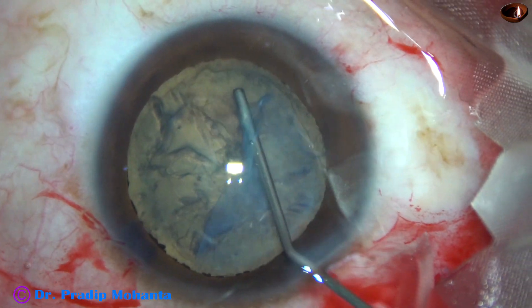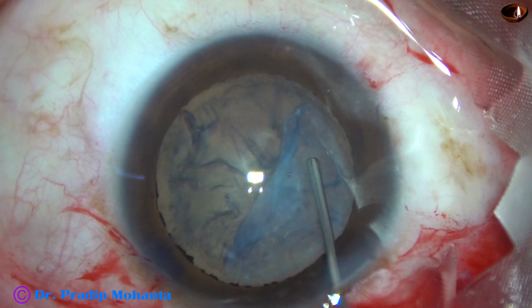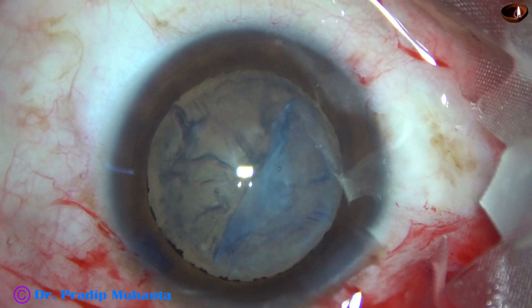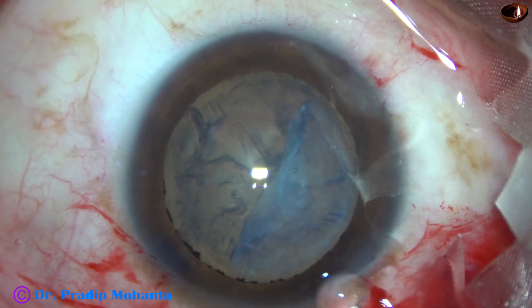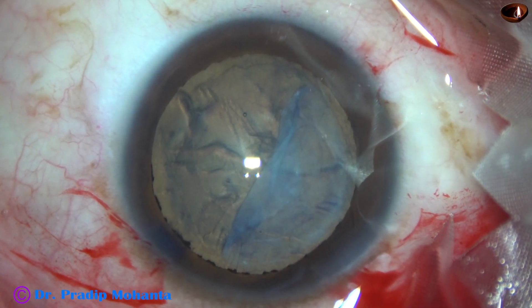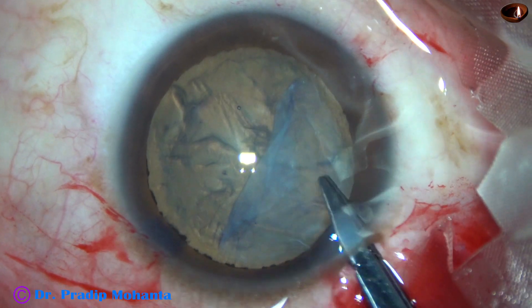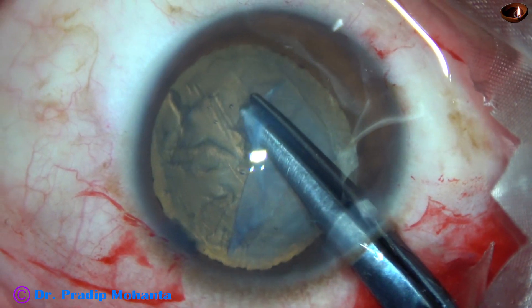Injecting, injecting — I find an opening here. So I take the Vannas scissor, pass one blade of the Vannas scissor through this opening, and cut this tissue.